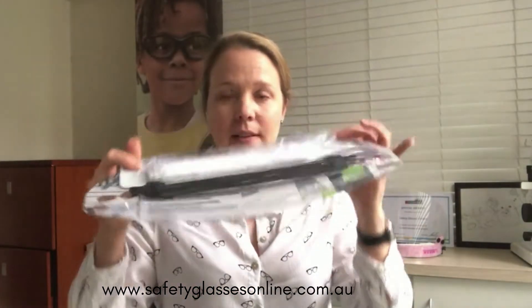Hi, I thought I'd explain how to put together one of the eye mask plus face shields. When you order a face shield from us that's from eye mask, it comes sealed like this.